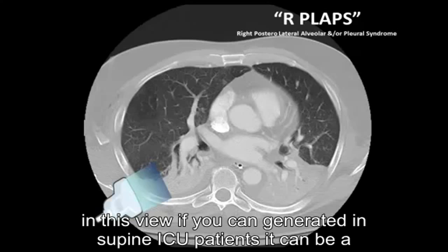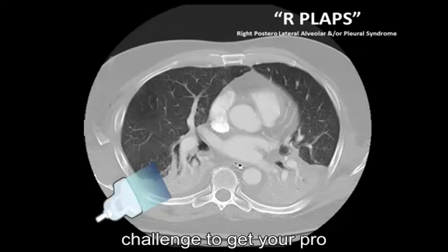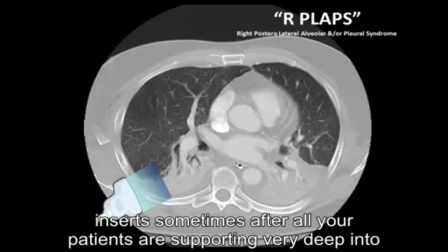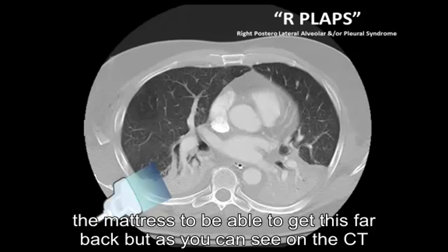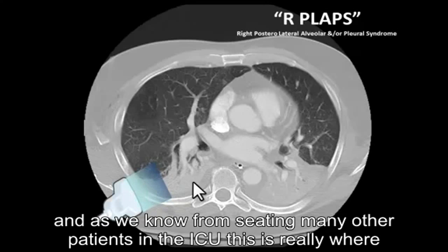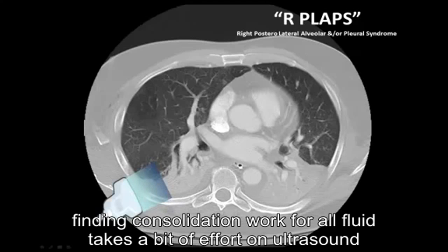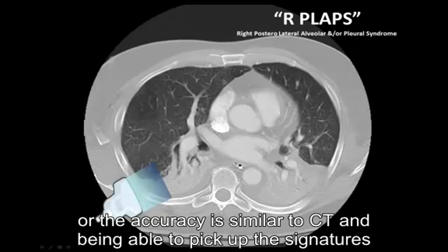In supine ICU patients, it can be a challenge to get your probe all the way back here, effectively almost at the margin of where the latissimus dorsi inserts. Sometimes you have to roll your patients or dig very deep into the mattress to be able to get this far back. But as you can see on this CT reconstruct, and as we know from CTing many of our patients in the ICU, this is really where a lot of pathology lies. Finding consolidation or pleural fluid takes a bit of effort on ultrasound. However, the accuracy is similar to CT in being able to pick up these signatures.